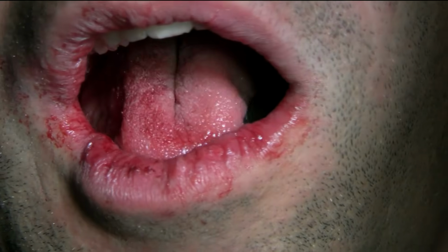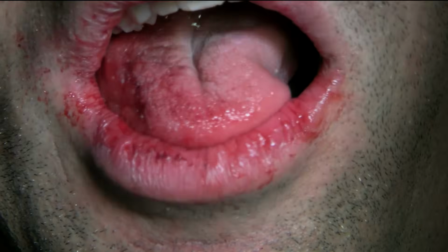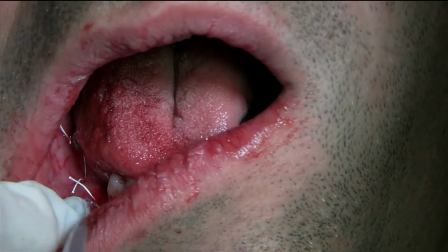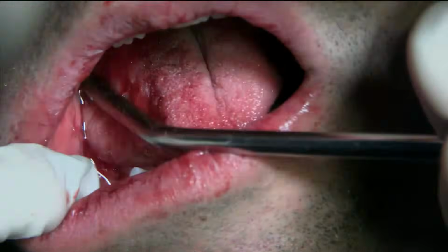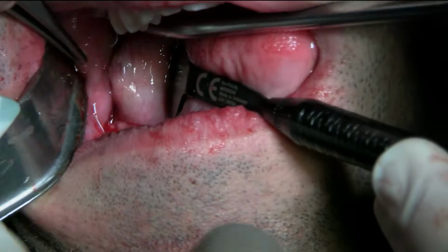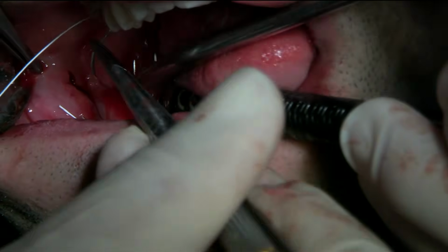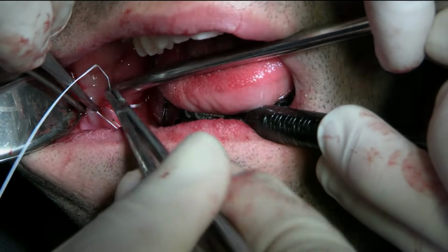So we'll take a new suture. I can still use this one, but for the mattress, when I get in the back of the posterior, it will be really hard to do with a short suture. I think a 4th mattress, and then we're done with the mattresses. I just want to have a mattress there.